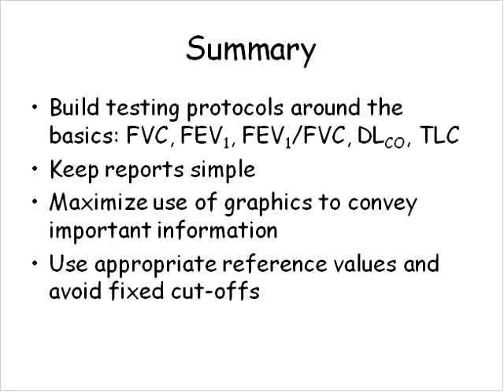And it's extremely important to keep the reports as simple as possible so as to not misclassify patients, and that the use of graphics, particularly graphics that can allow us to show how much variability there is in the normal healthy population, can be very important. And then last but not least, I think it's important that we think about the best way to present that data, and the way that most of us do it now, in terms of using percents of predicted and fixed cutoff values, may not be the best in terms of making the best diagnostic decisions for patients, particularly patients that have obstructive lung disease.